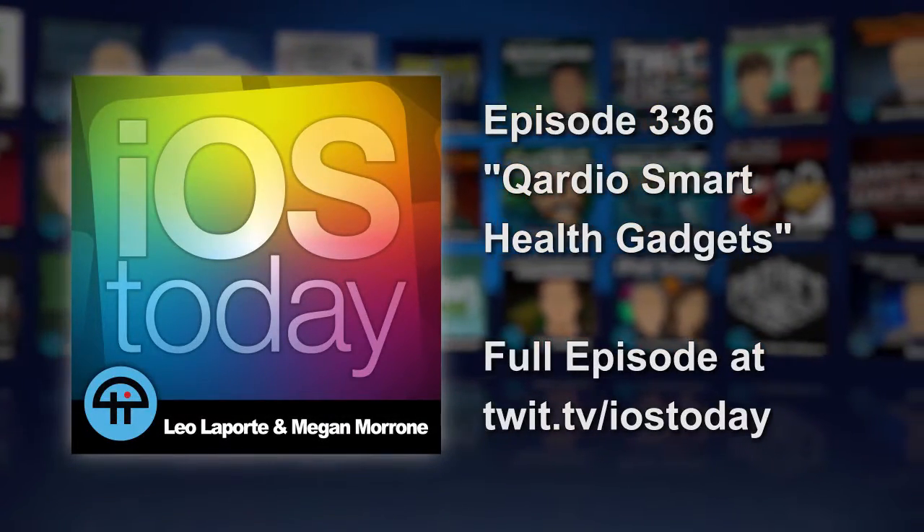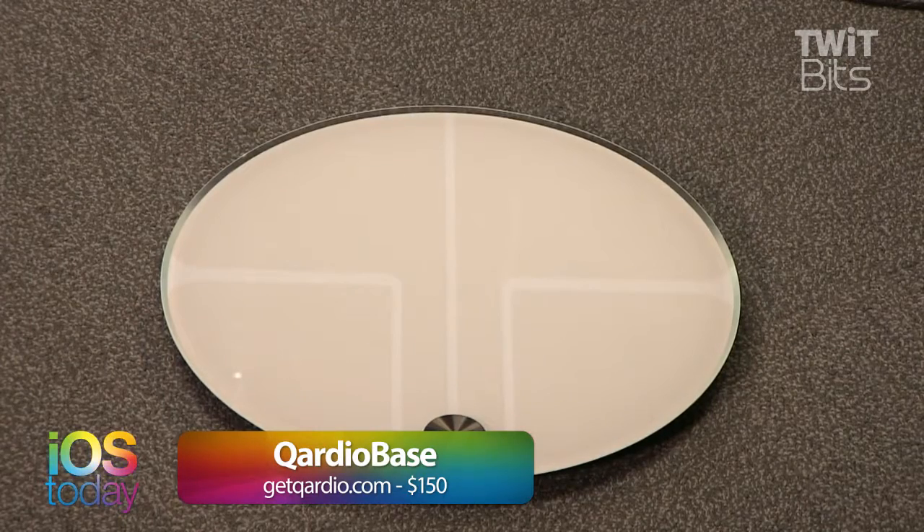We have two products from a company called Qardio — that's with a Q. The first one is a scale called the QardioBase, there on the floor. It looks like a regular smart scale, it's $150, which is not cheap, and it connects to an app. Brian is going to stand on it and be our weighing model.